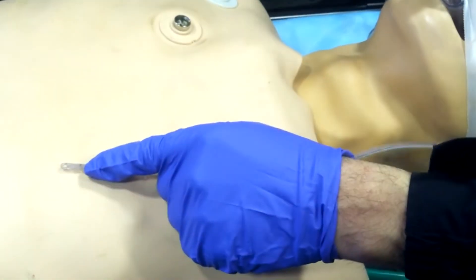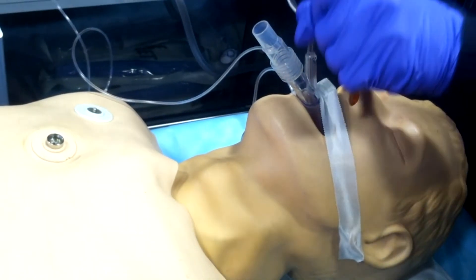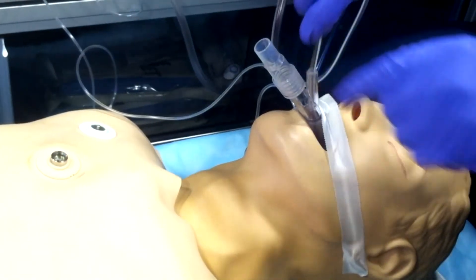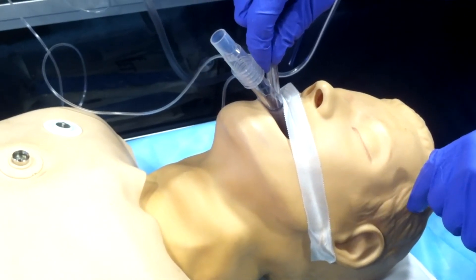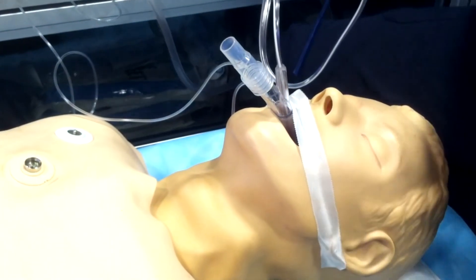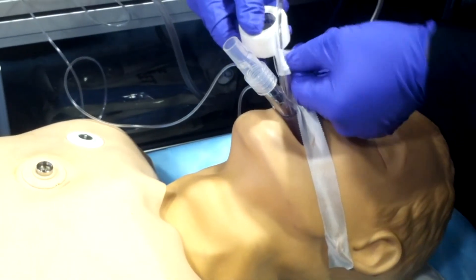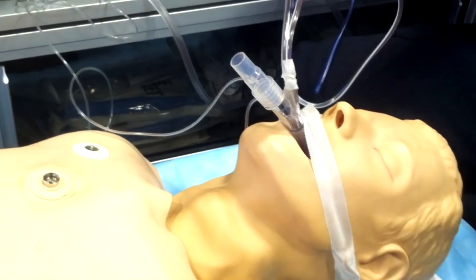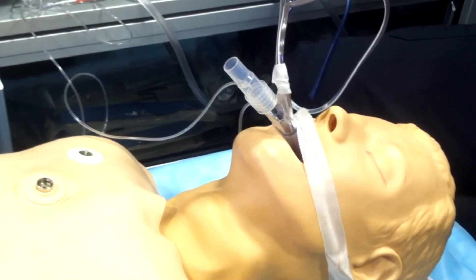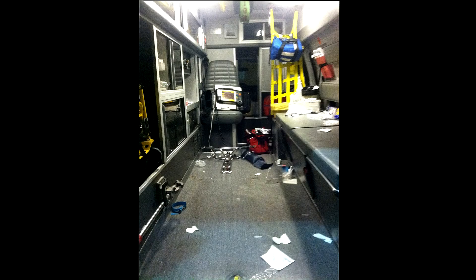Properly measure from the stomach to the top of the port, lubricate it, and insert until you meet resistance or reach your marker. Once at your marker, confirm it's in the stomach — not accidentally in the trachea. With the LMA Supreme it's virtually impossible to tracheally suction through the drainage port. After placement, secure it down — appease the trauma gods — and then you can start suctioning. Make sure it's properly placed and secured before suctioning. And that is the end of our training.